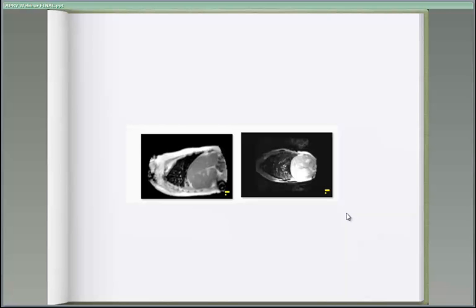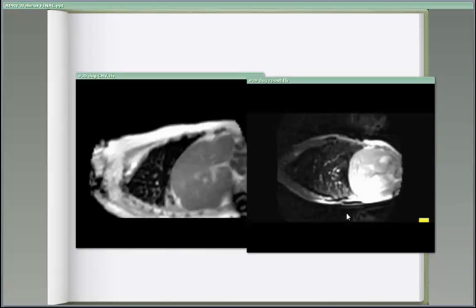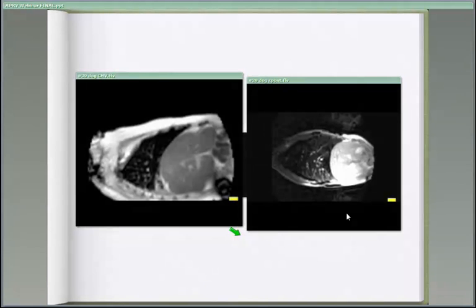Now, this is one of the reasons why several studies have shown better gas distribution with unassisted spontaneous breathing versus assisted spontaneous breathing, which is anything from mandatory ventilation to pressure support ventilation. And the reason might be that we're pushing gas into the lung versus pulling gas into the lung. And I just want to show you a couple examples of that.